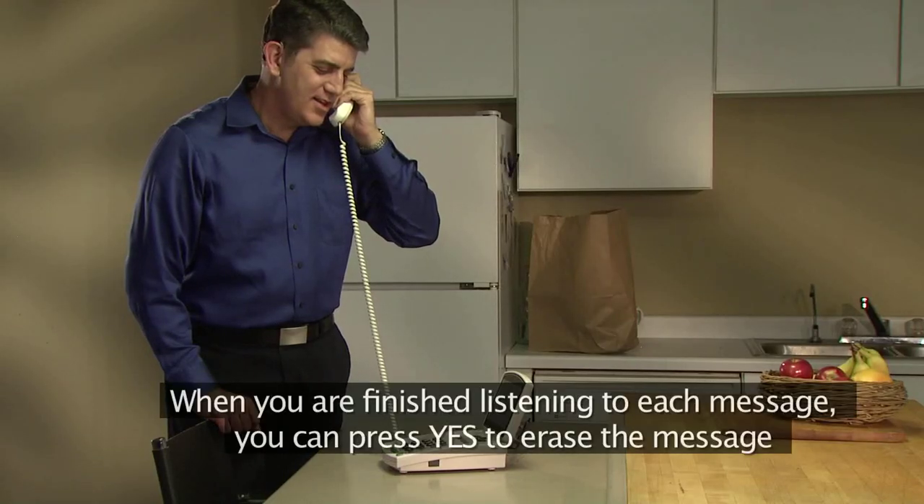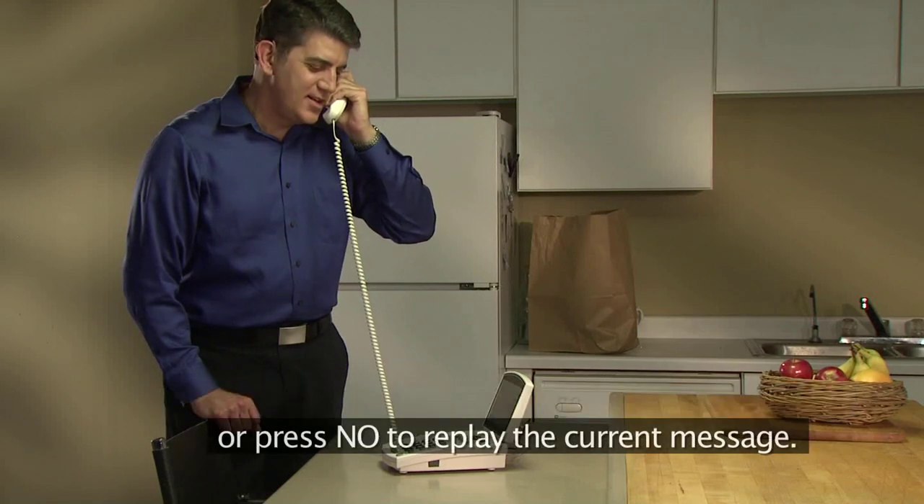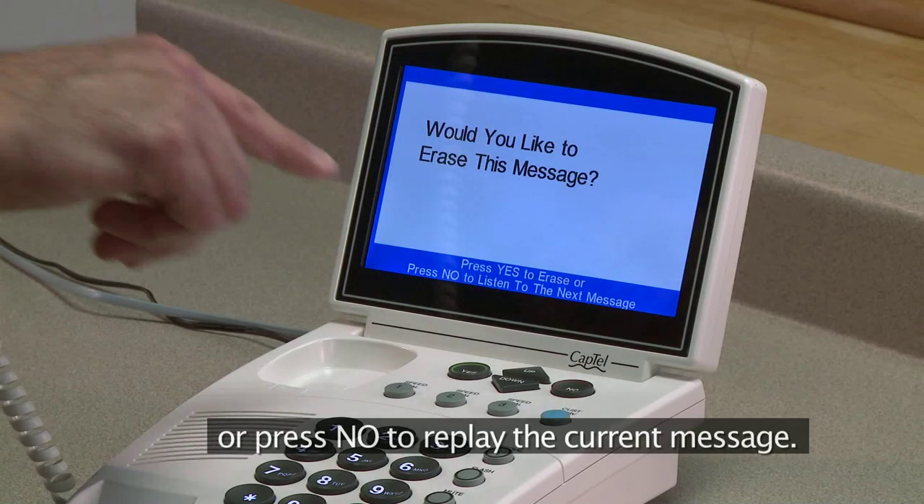When you are finished listening to each message, you can press Yes to erase the message or press No to replay the current message.